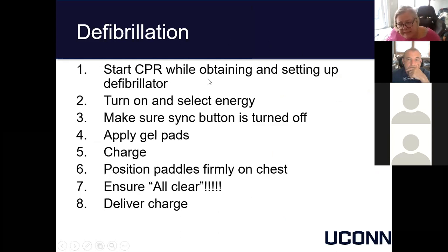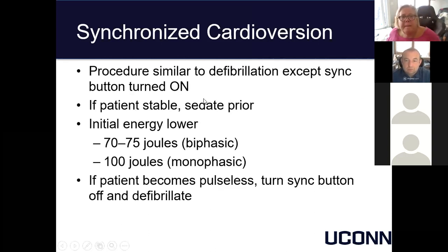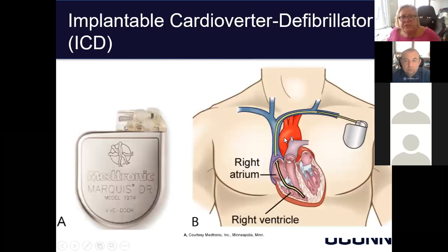Again, you got to maintain CPR, you got to maintain oxygen delivery while you're getting ready and just prior to shock and after shock. Whether it's cardioversion, defibrillation, whatever, you need to ensure that everyone is clear and away from the bed. And then you apply the charge. And again, synchronized cardioversion, we talked about that. Again, usually done at a lower energy.